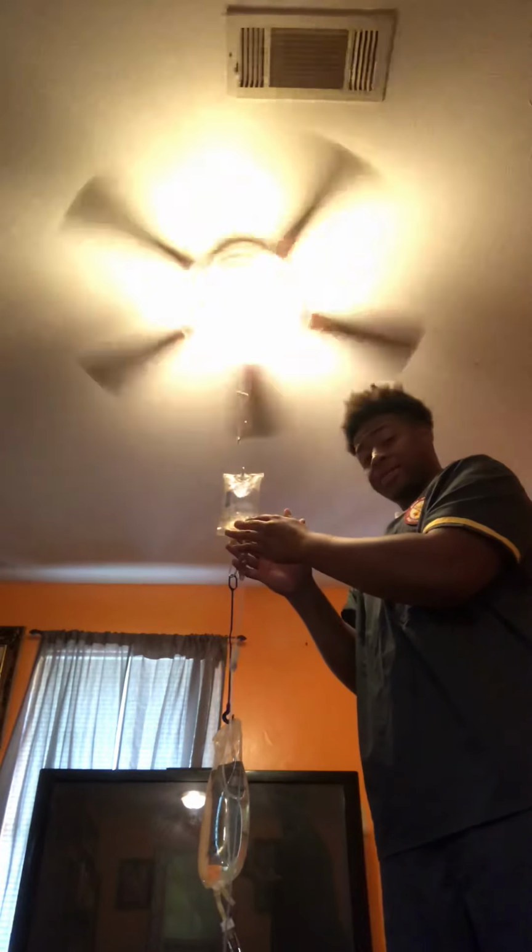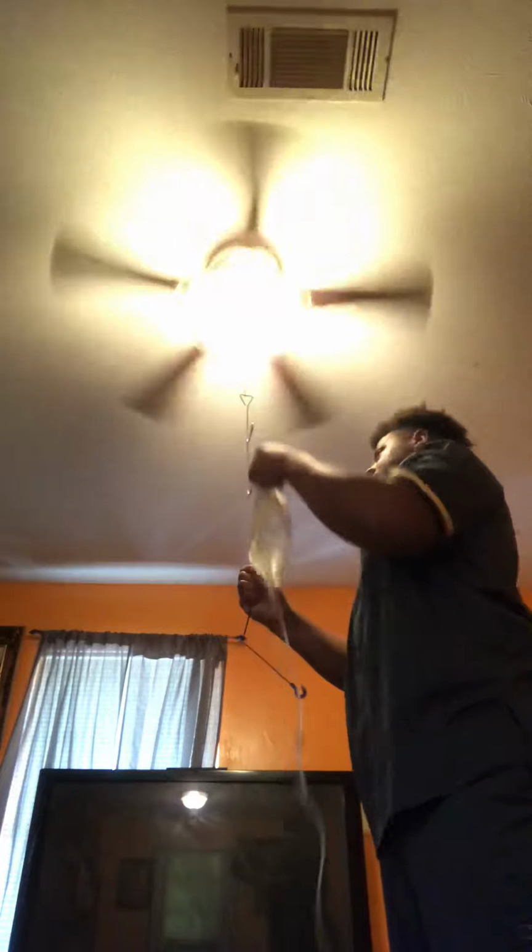All right. So now I'm going to show you how to disconnect everything. So you would walk into the patient room, knock on the door, identify the patient, identify yourself. After all of this is done and complete, you would take this off, detach this. All right. Dispose of this to where it needs to be disposed. Grab your big bag, hang it back up high. Get the hook, dispose of the hook. And then you would, of course, document.